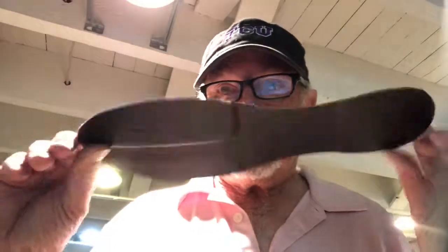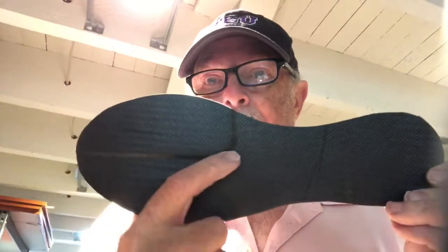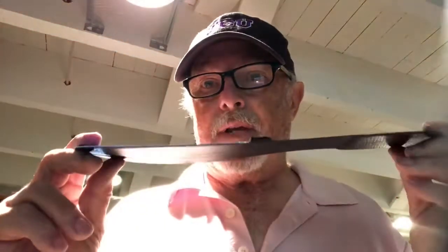My TCU blade for sesamoiditis — this has a drop here that creates a wedge, wedging it laterally to take the weight off the first metatarsal. You can see there's quite a drop-off here for relief.